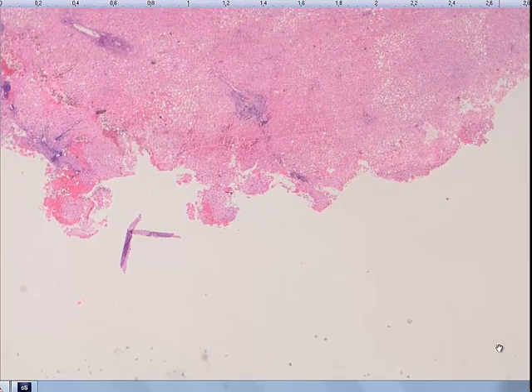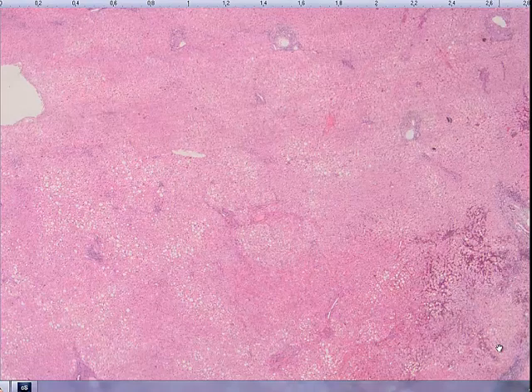Today what we have is a consultation case which we received from an outside center. It belongs to a 60-year-old female, and we have the blocks of the liver this time. The patient is supposed to have nodular lesions in the liver, and also has a history, 6 months back, of pancreas surgery due to a non-neoplastic, cystic lesion, we're told, and also peritoneal lesions as well, which we do not know the details of. Anyway, what we got was, as I said, the consultation blocks of the liver.